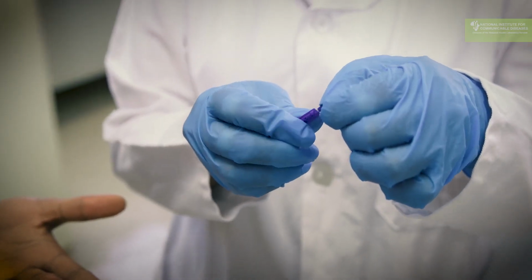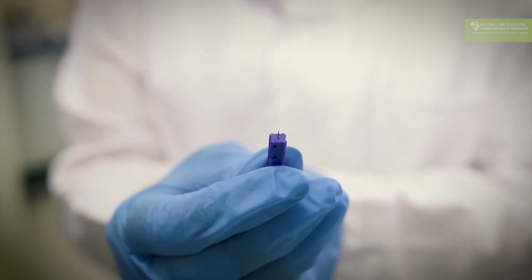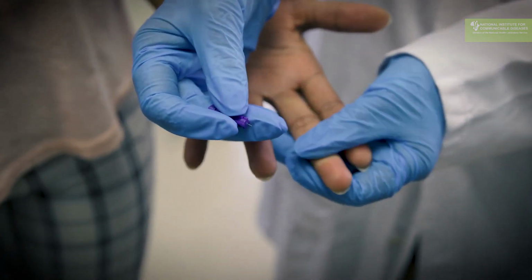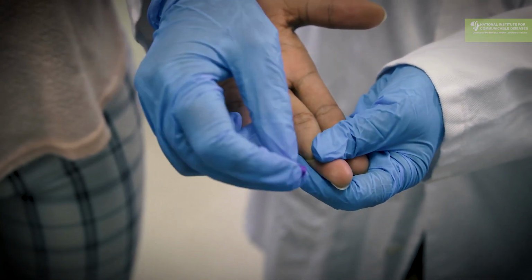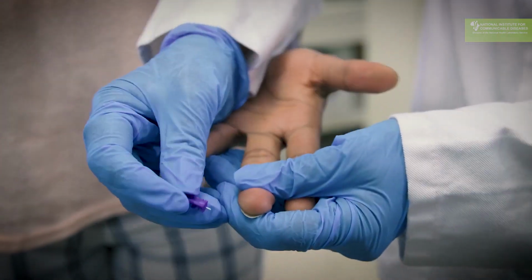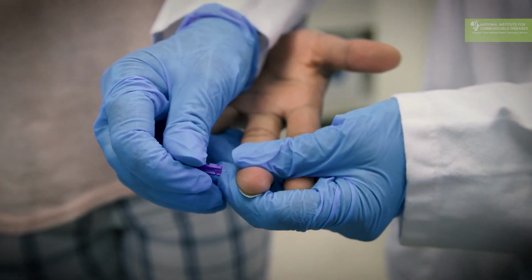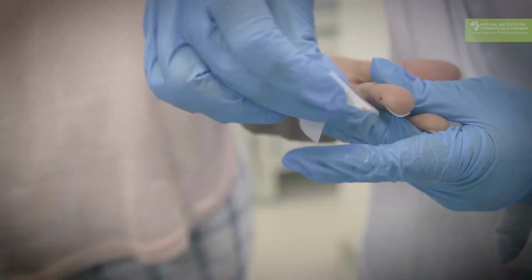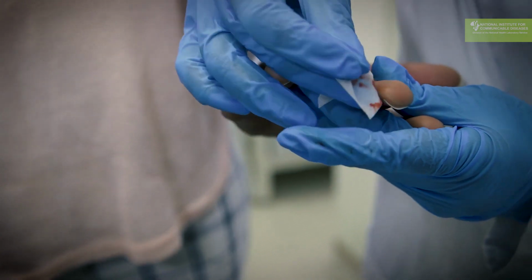You twist off the lid, and then you have the sharp needle. This needle is what you use to prick the finger. You're going to hold the finger pretty tight so you get the blood pooling. You never prick at the center, you're going to prick off center, and you do it in one smooth movement. You wipe the first drop off.